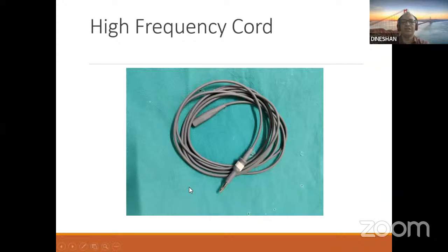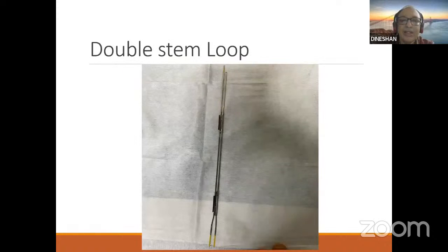This is the high frequency cord. This is the area which is connected to the pillar. This is for the single stem loops where it is connected to the pillar, and for a double stem you have a different type of loop, high frequency cord, which is connected to the right, which has got a small hole at the right side, so that it gets connected straight to this active limb of this stem of this tube. So that's a different type of high frequency cord.